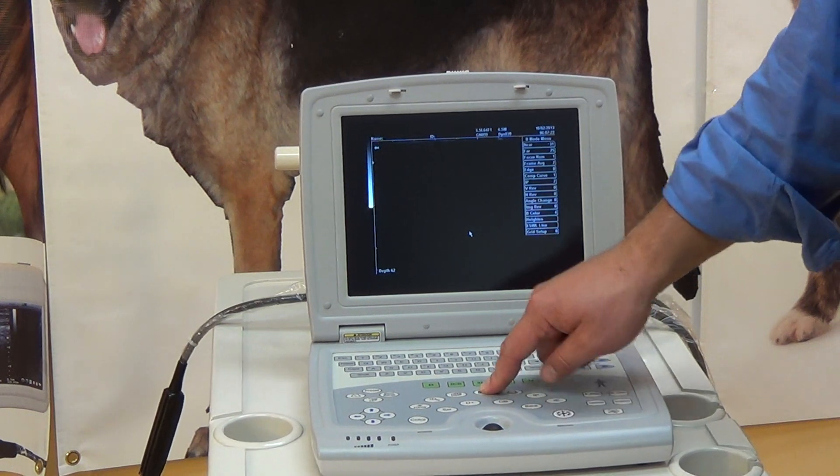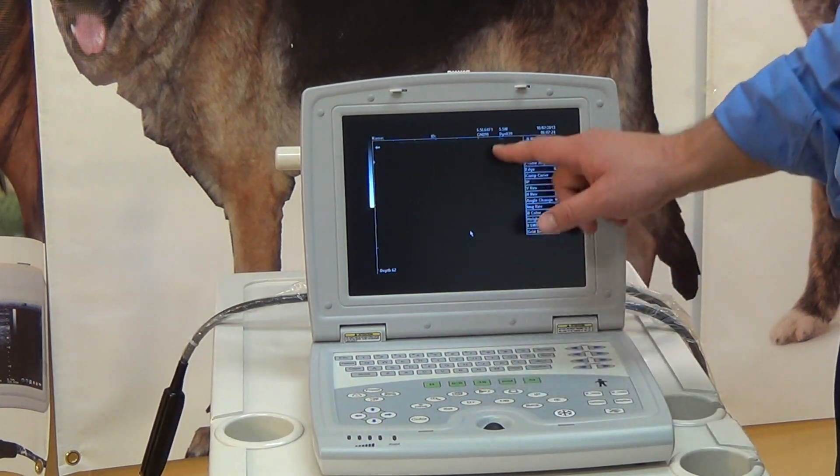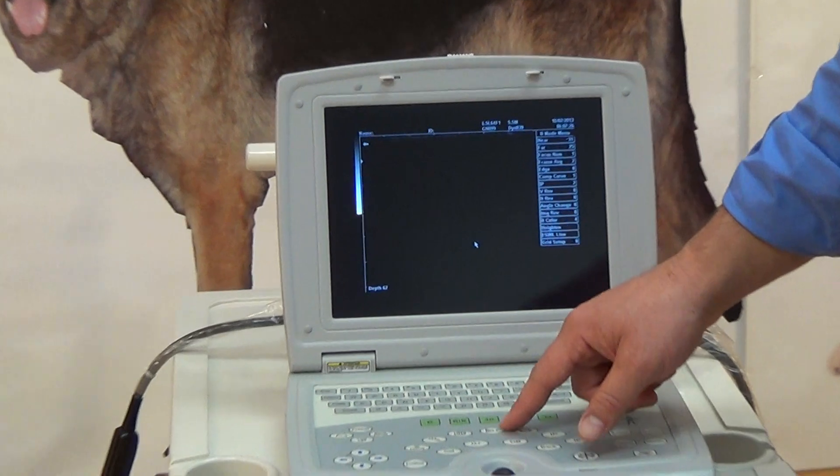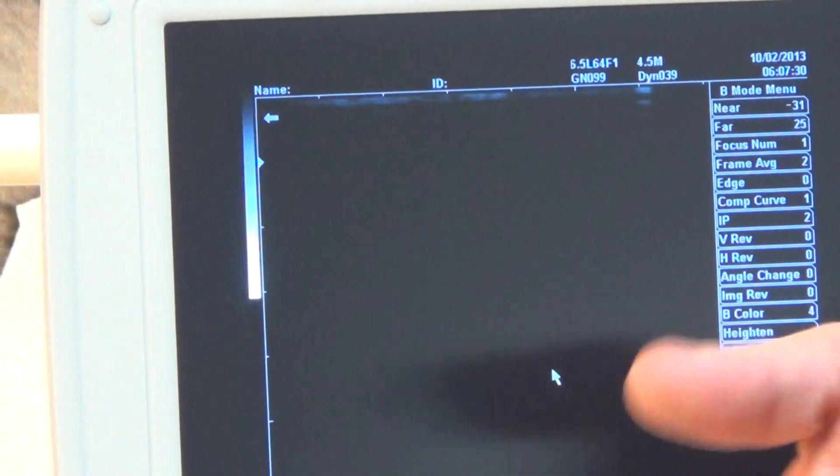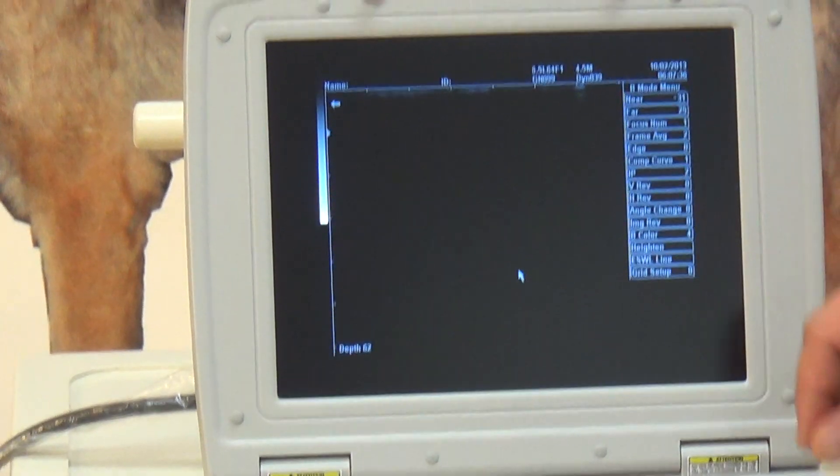This button here changes your frequency. So that is a button that most people do use, and that's signified up here. The lower the frequency, the deeper you penetrate into the animal that you're looking at, the less resolution. The higher the frequency, the shallower you can get, but the more clear the image will be.